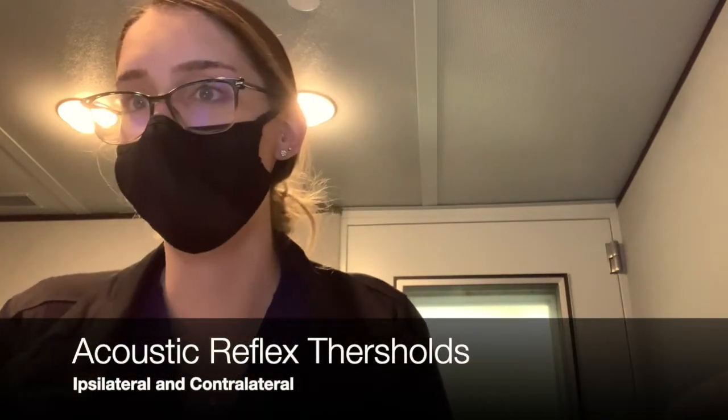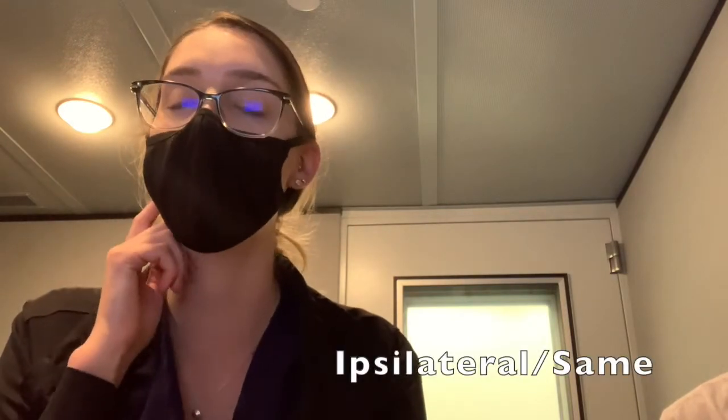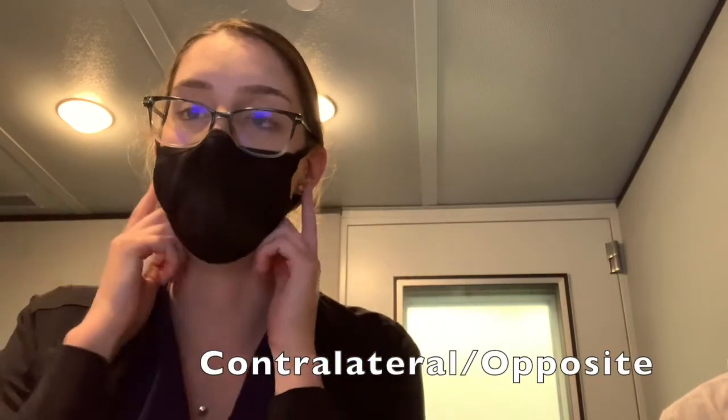All right, so once you've completed tympanometry, you're going to want to move on to acoustic reflex thresholds. Acoustic reflex thresholds test your auditory pathway further, and you can do it in the ipsilateral ear, or same ear, or with contralateral ears, or both ears. So this reflex system can track how well the sound is being transmitted throughout the nerves and make sure that it is functioning properly. It is done either with the probe and the stimulus presented in the same ear, or with the probe and stimulus presented in separate ears.